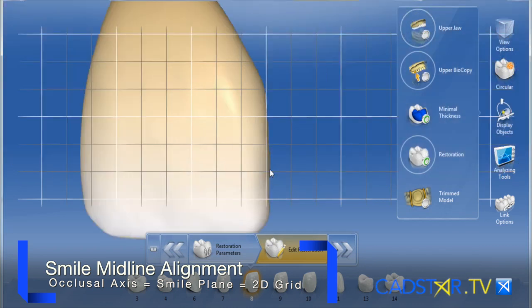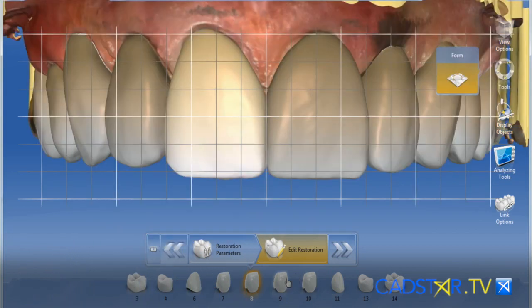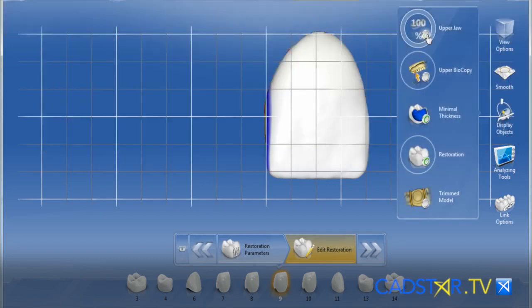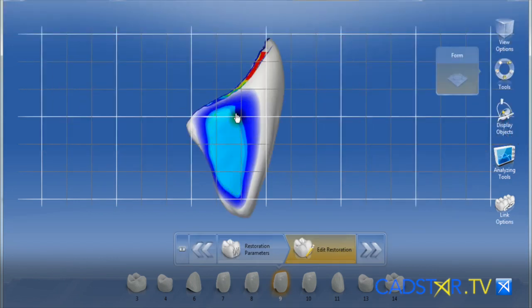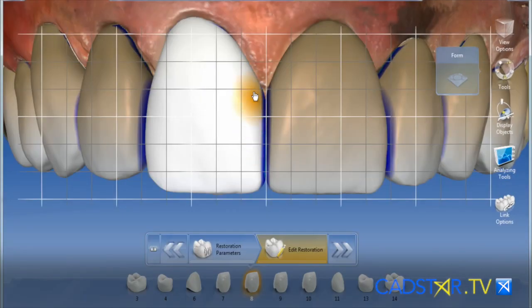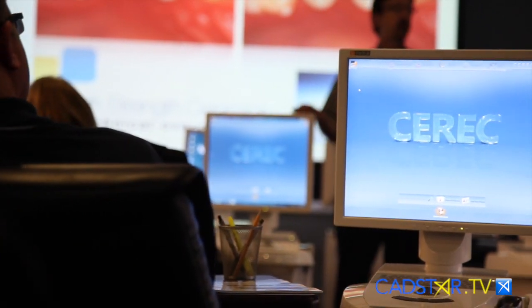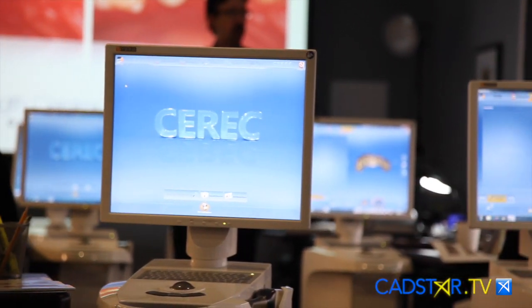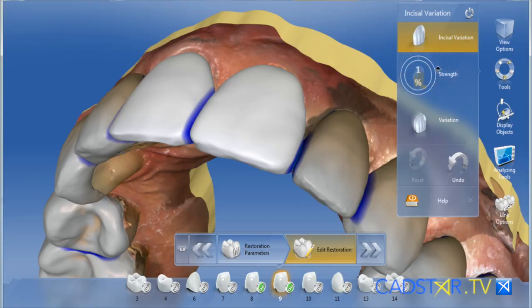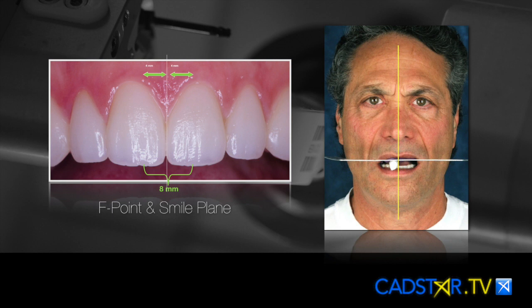I'll finish the one central first and finish that interproximal contact using the 2D grid. Then I'll build the adjacent central midline to that plumb line of the first tooth I designed. Using that approach — placing the contact in the proper location and creating that interproximal footprint — and we go over that in my mastering aesthetic class. Now that we have incisal variation and setting your midline up, if you follow the rules, and they're easy rules to follow, you'll really be able to master that.